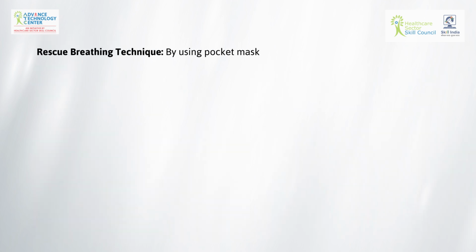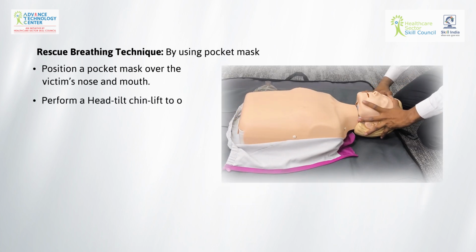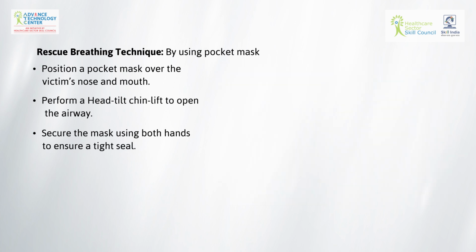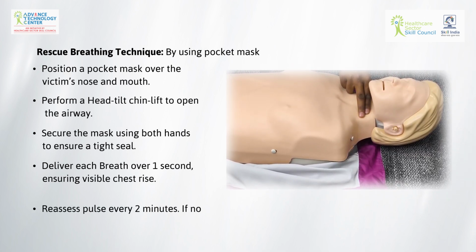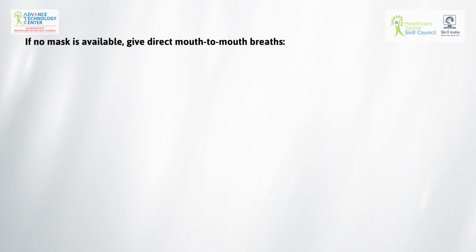Rescue breathing technique. Position a pocket mask over the victim's nose and mouth. Perform a head tilt chin lift to open the airway. Secure the mask using both hands to ensure a tight seal. Deliver each breath over 1 second, ensuring visible chest rise. Reassess pulse every 2 minutes. If no pulse is found, begin chest compressions. If no mask is available, give direct mouth-to-mouth breaths.